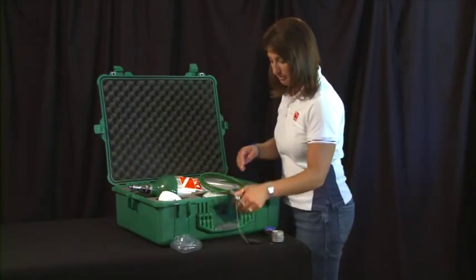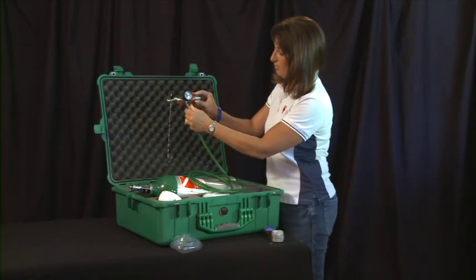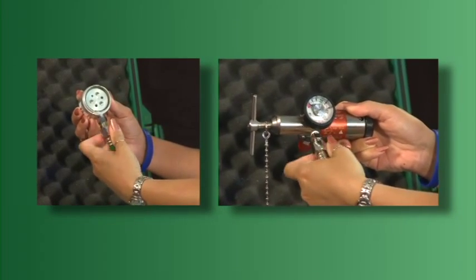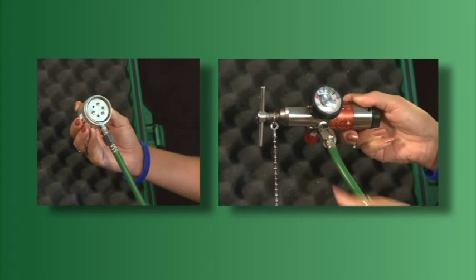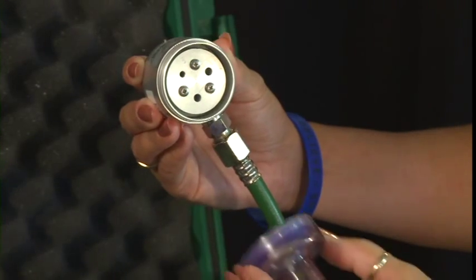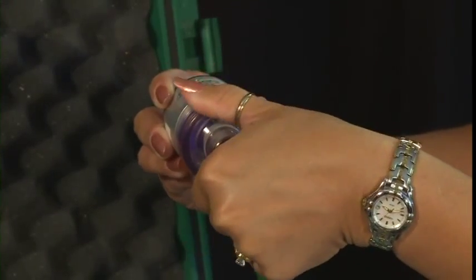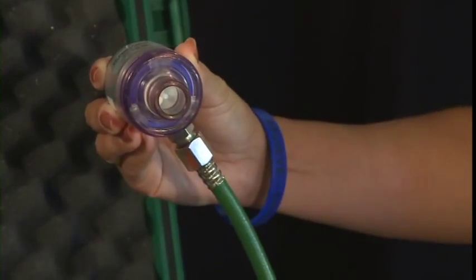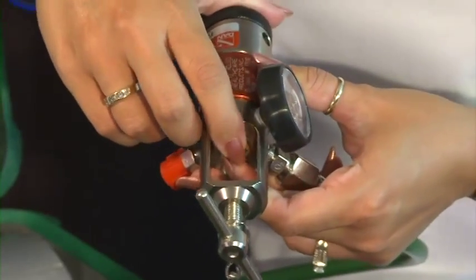Once the parts are clean and dry, you should assemble your DAN oxygen unit and store it for another day. Attach the oxygen hose to the demand inhalator valve and multifunction regulator so that it's finger-tight. To avoid cross-threading the plastic mask adapter and valve, first screw the plastic adapter in a counter-clockwise direction until you feel the adapter find the groove of the valve, then turn in a clockwise direction. Place the oxygen washer on the regulator inlet and connect the regulator to the cylinder.